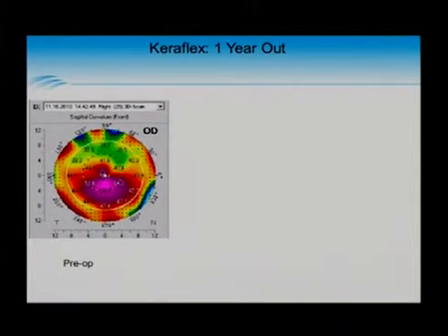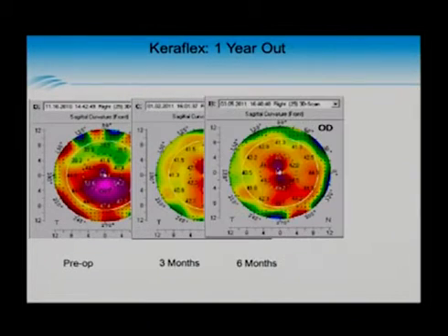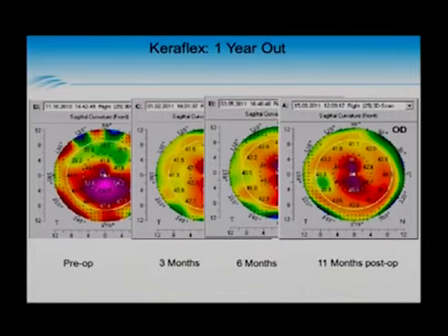Here's one patient almost a year out. Here's the pre-op, 3 months out with a beautiful, regular, small amount of astigmatism centrally, a very regular topographic appearance now. 6 months out, good stability. 11 months out, good stability. Still excellent visual acuity with spectacle corrections.